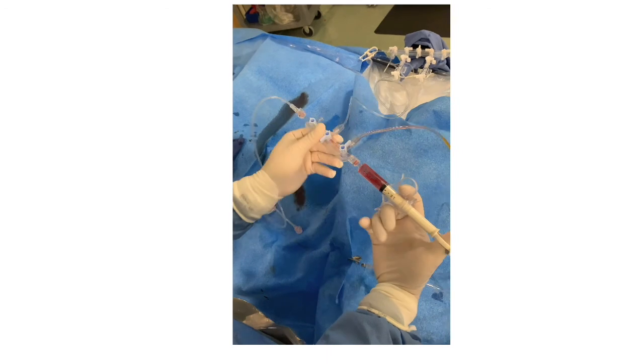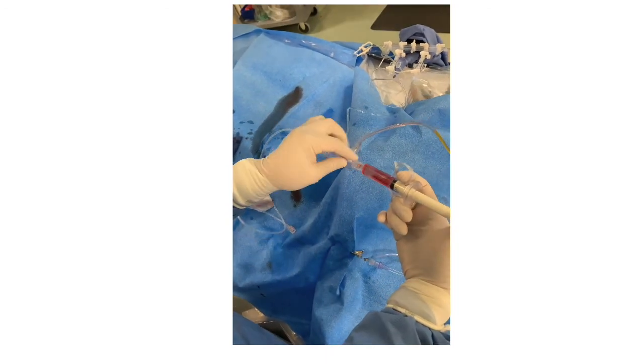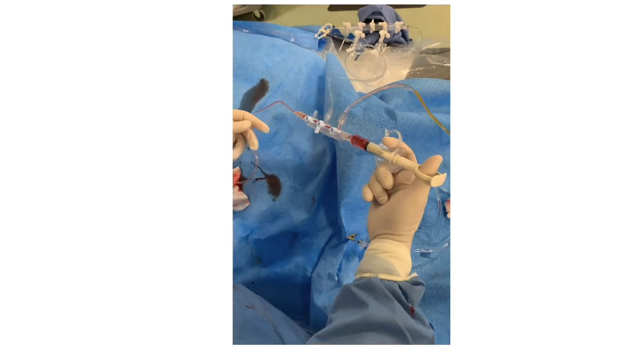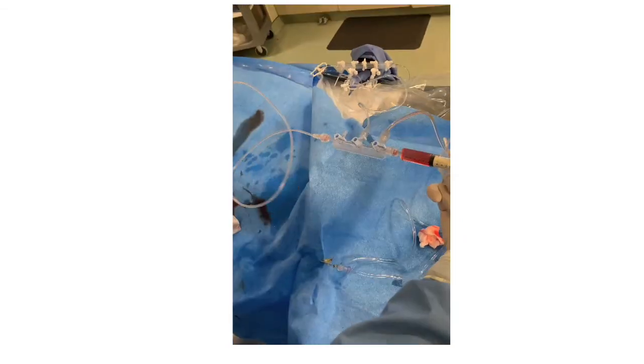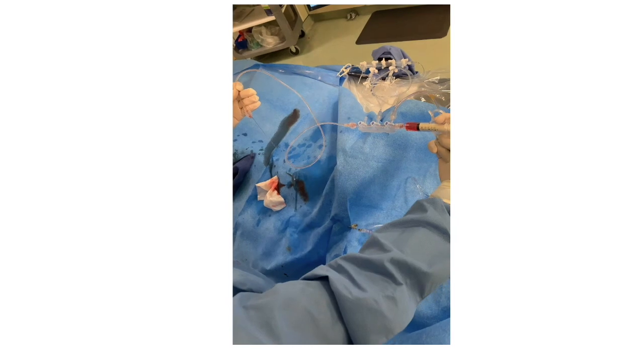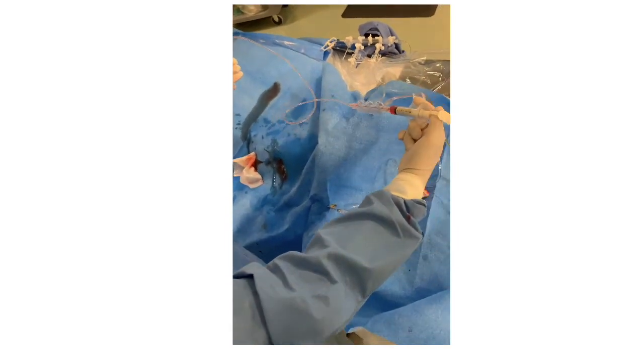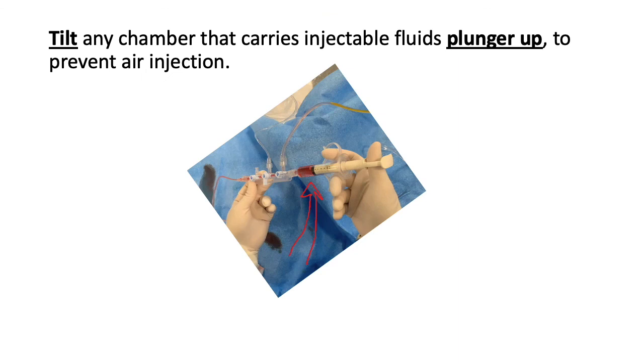I've turned off the saline and now I'm drawing up contrast into the chamber. We're going to go into neutral default position here. And we can inject forward out of the chamber.